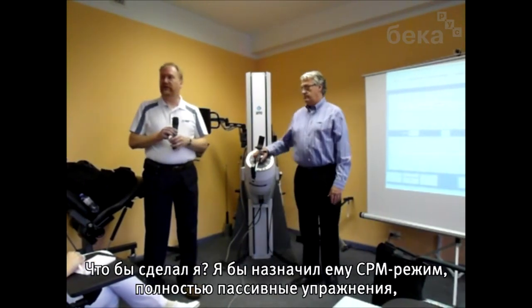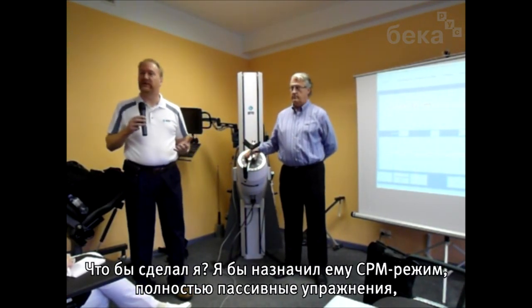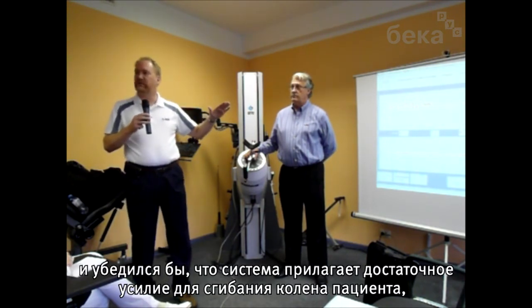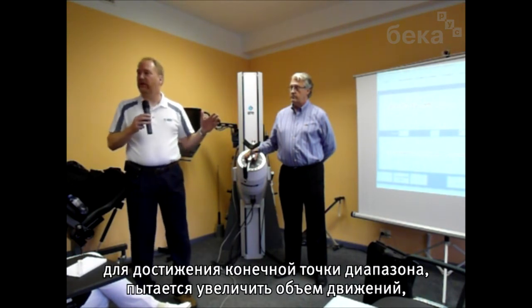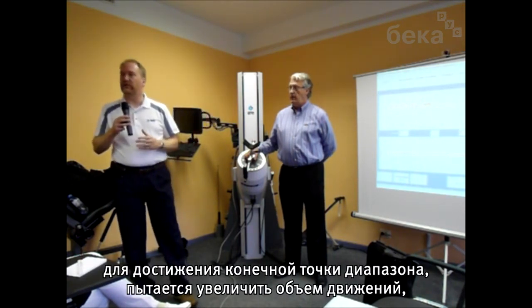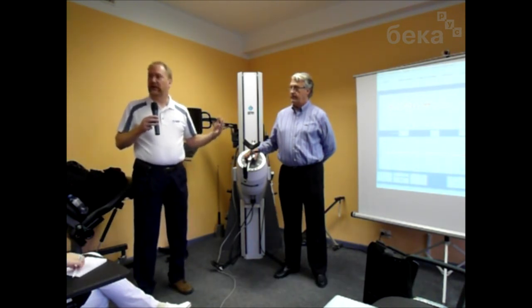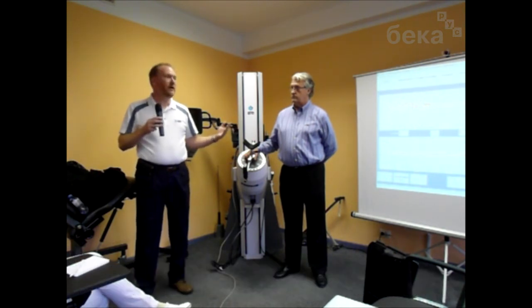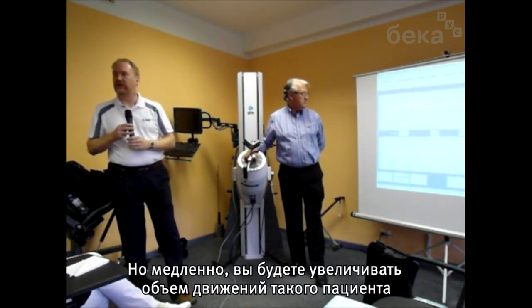What I would do is set them up in the CPM mode, so it's an entirely passive exercise, and make sure that the machine can push the person's leg into knee flexion to stretch that endpoint of the range, to try to increase range of motion, and so that scar tissue releases a little bit. It's going to be a slow process. You may only be doing a few degrees extra per day or per week, depending on what they can tolerate. But slowly you should be able to increase that person's range of motion.